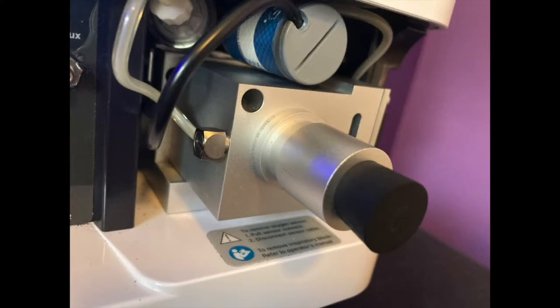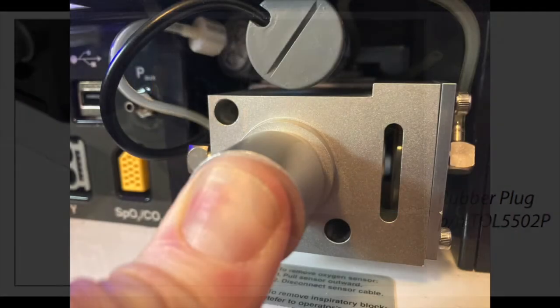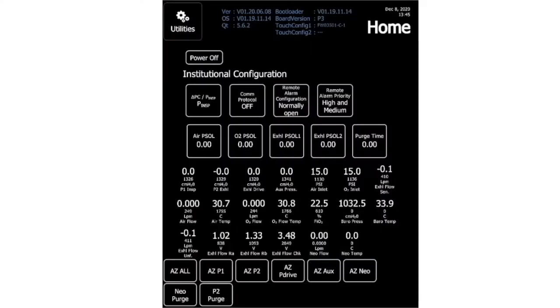I need to find out which side my leak's on. I'm going to first check my inspiratory side, so I'm going to isolate it. I'm going to use a rubber stopper. This comes in the calibration kit, or you can order it. Or if you don't have the rubber stopper, you could just use your thumb to occlude it. I do not want to occlude the inspiratory side yet. I want to turn on my airflow first.